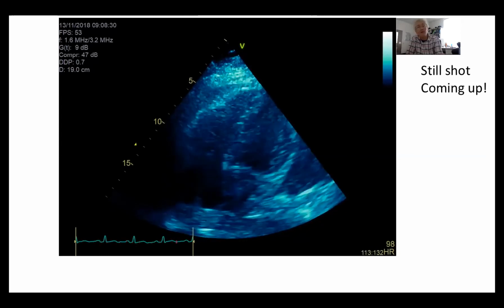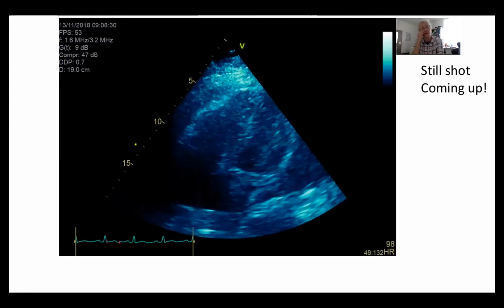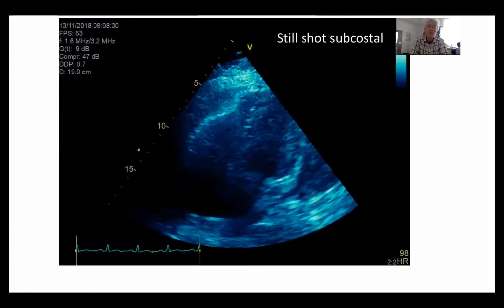We've only got the right ventricle. Yeah. And left atrium also looks like it's an oblique shot. So we're getting the wall coming completely together. So it's obviously not perpendicular to what we want. So here's a still shot of the subcostal. Arnie? Yeah, I see some indentation of the right ventricular free wall, and that's early diastolic, so that would fit with what we just mentioned. Okay, so far everyone's been thinking that it's tamponade, or is there anything else in addition to this?